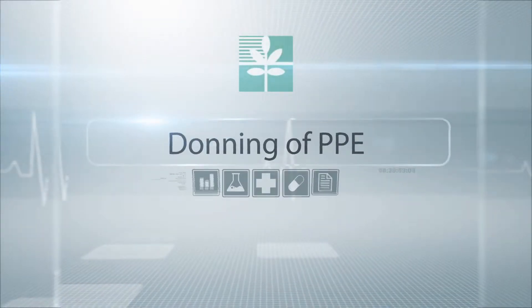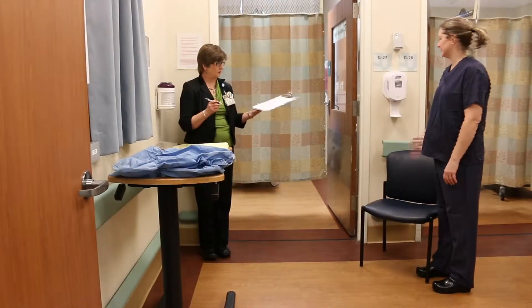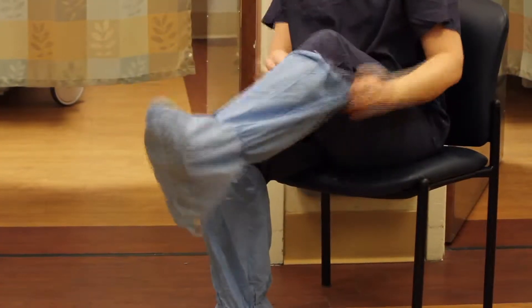Donning of PPE. First, remove your jewelry and accessories. Sanitize your hands with Purell. Then, put on your tall surgical booties to cover your feet and lower legs.